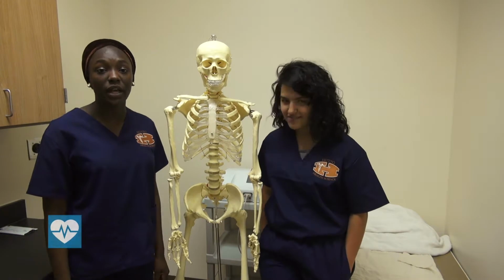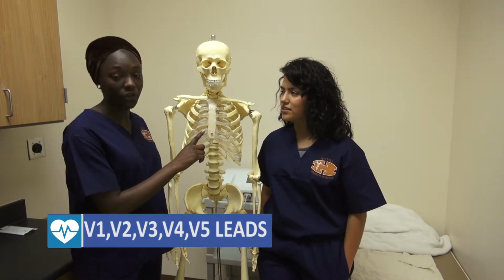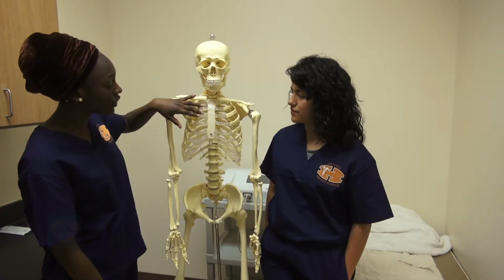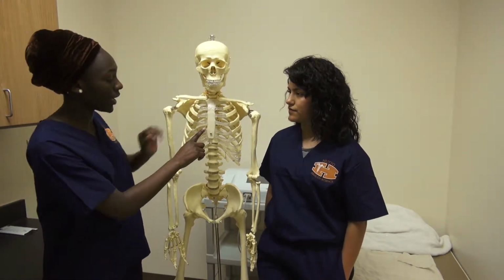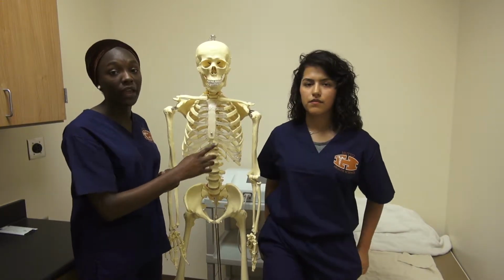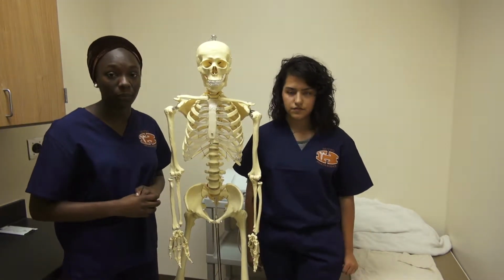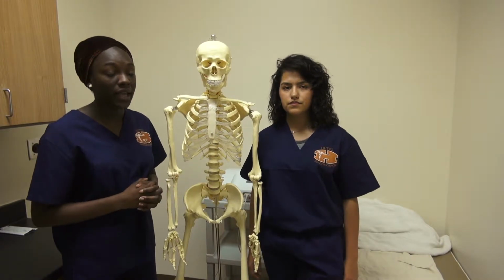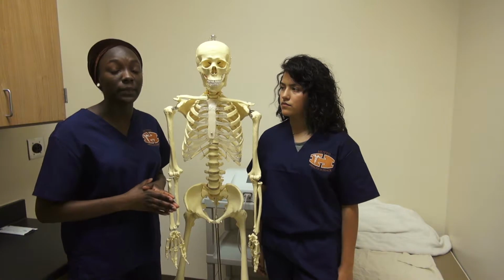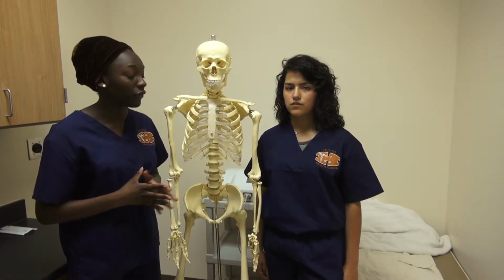V1 is going to be placed on the right side of the sternum in the 4th intercostal space, and you can do this by measuring from the clavicle. So 1, 2, 3, 4, right here. As for V2, it's going to be placed on the left side of the sternum in the 4th intercostal space as well. The next lead we would place is V4, and the reason for that is because V3 is placed in between V2 and V4.